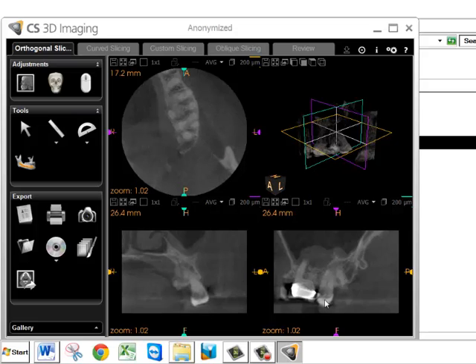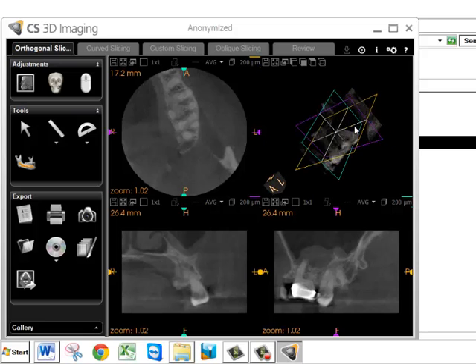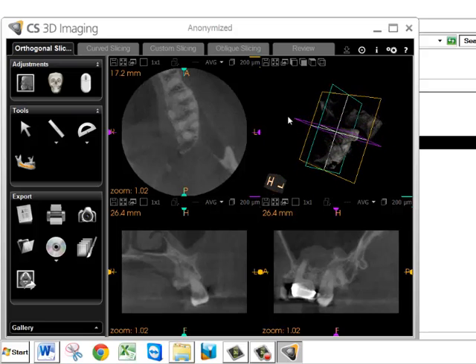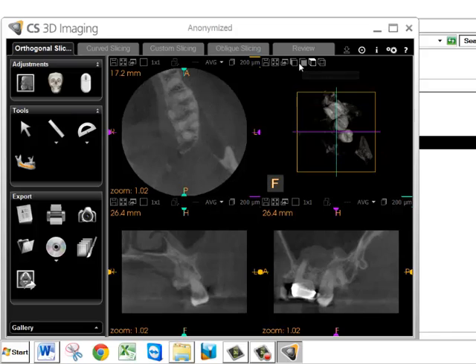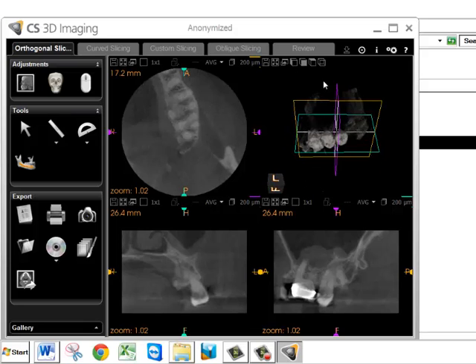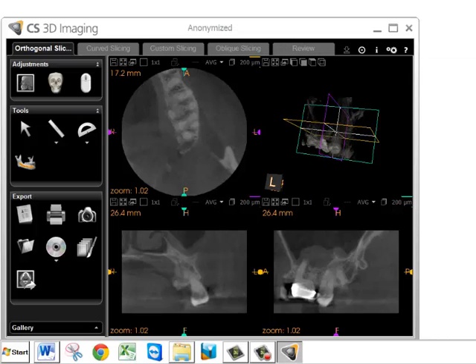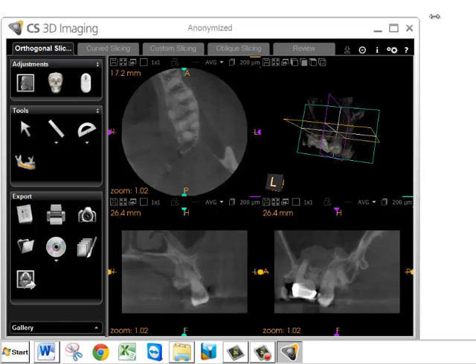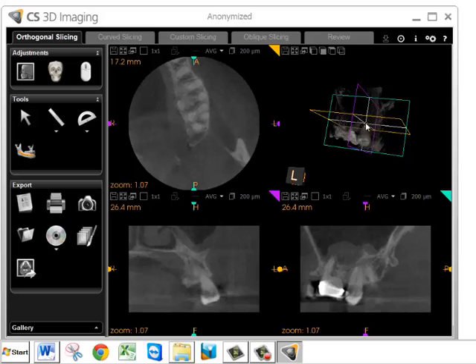There are four main windows. The upper right is the 3D window. You can return it to any one of the neutral positions by clicking on one of these boxes. The 3D volume, in my experience, is not all that helpful in diagnosis, but what it does allow you to do is be oriented as to where you are in the particular volume.